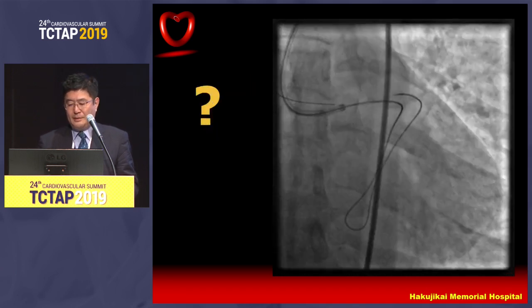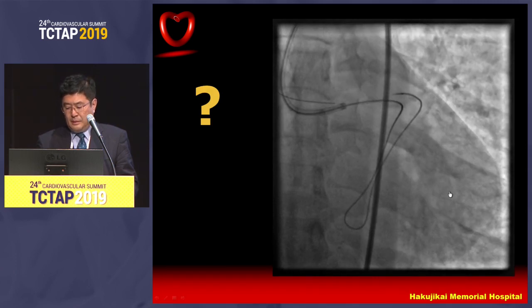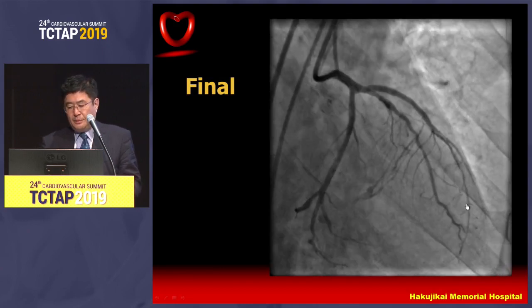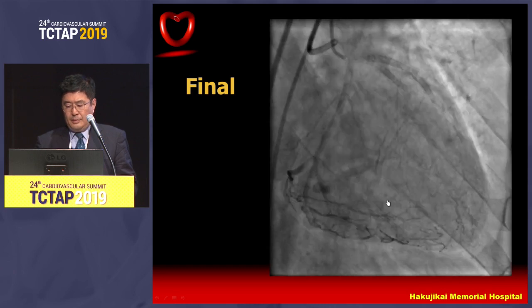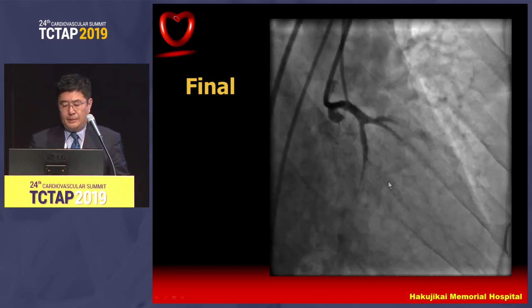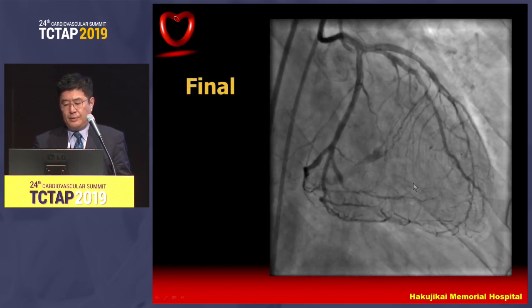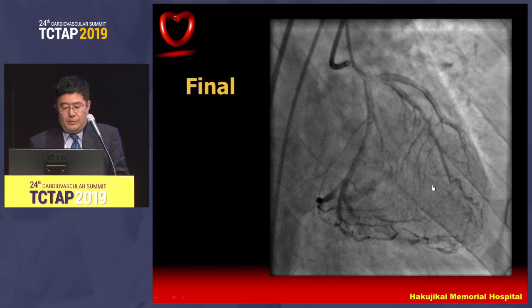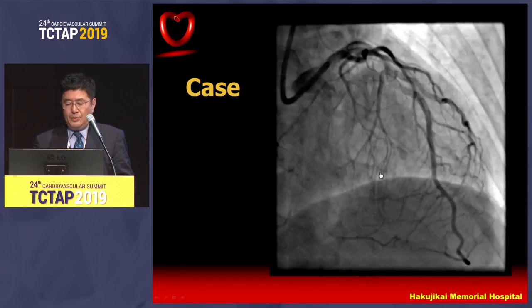At the time, I forcefully pushed the Corsair catheter, and I just took a look at this point. However, just after, the Corsair catheter made damage. And this is the final result. We can see the perforation, but the contrast disappeared, so the hematoma has some connection to the right or left ventricle. At the time, I didn't do hemostasis as well, and the clinical course was okay. But septal injury is not always safe.